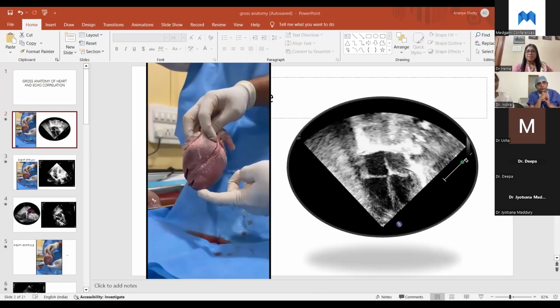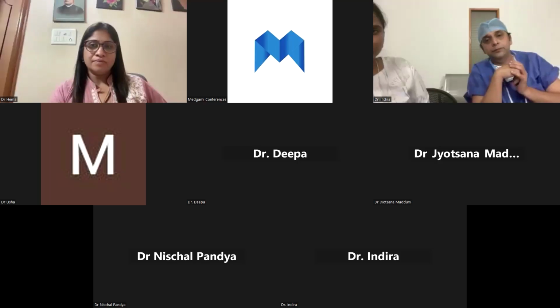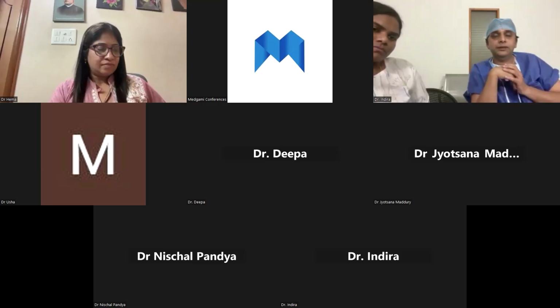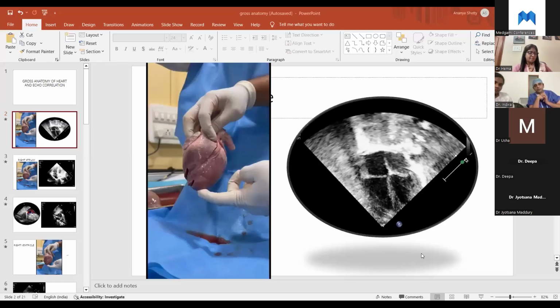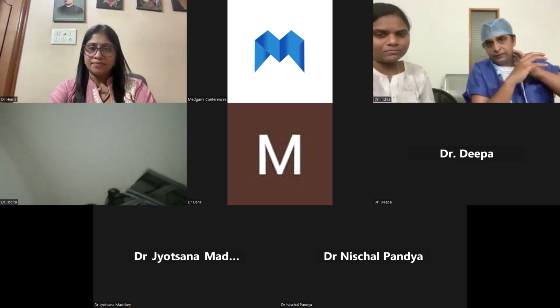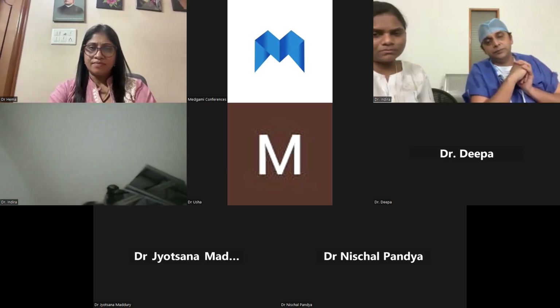So then two things. If it's just beneath the aortic valve in the muscular septum, it's an outlet muscular. If it's below the tricuspid in the upper part of the muscular septum but posterior, it becomes an inlet muscular. In between, just beneath the perimembranous region, you look at whether you are seeing the aortic valve opening or the tricuspid opening. When you see the aortic opening, I would call that an outlet muscular. And if I'm seeing the tricuspid valve in that shot, then it will be an inlet muscular.